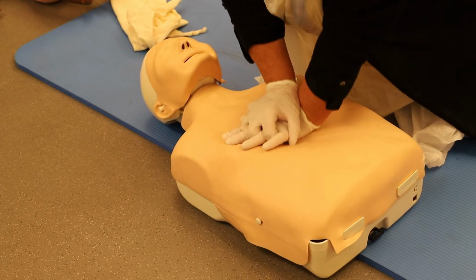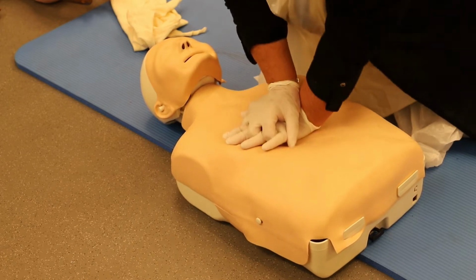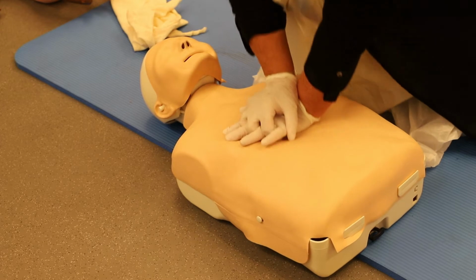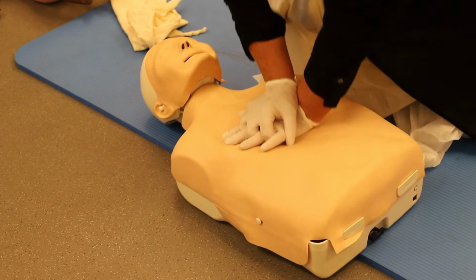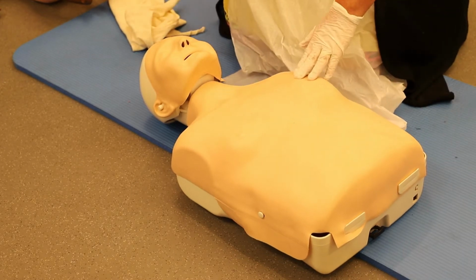10 and 11 and 12 and 13 and 14 and 15 and 16 and 17 and 18 and 19 and 20, 21, 22, 23, 24, 25, 26, 27, 28, 29, 30. We'll give our casualty 2 breaths.